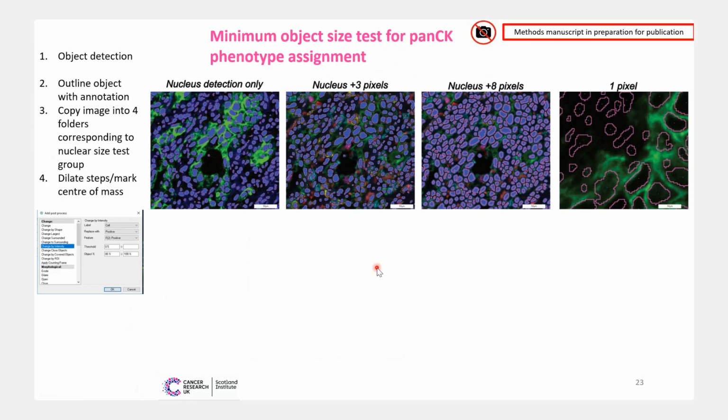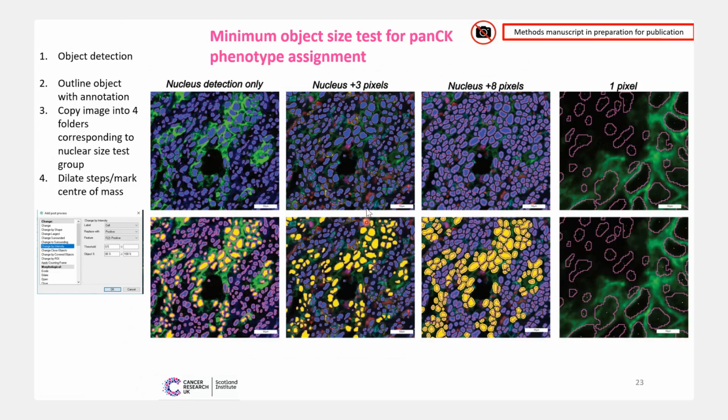Replace with a new positive label, which you can see here is in yellow. If it's 50%, so 0.5, sure that it belongs to the positive feature for cytokeratin, which we thought worked actually quite well, just even by looking at it by eye.